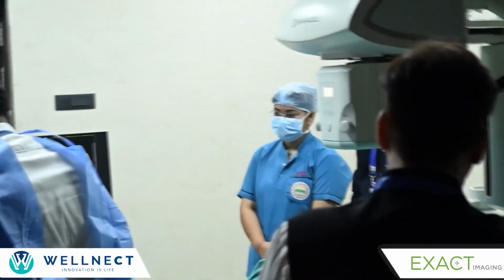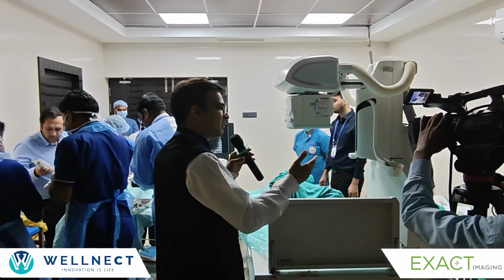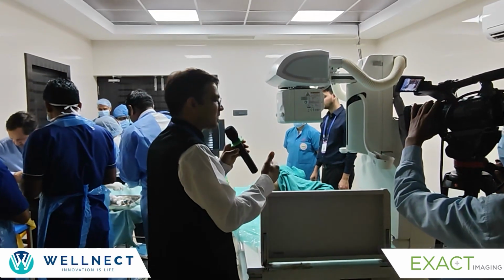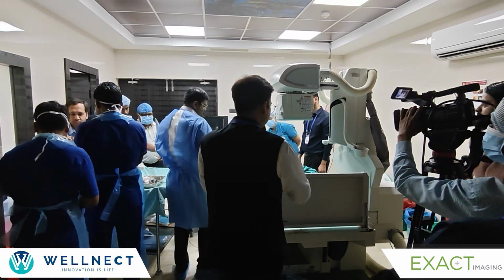Rest, if you go with the probe, all the features are equally there in both this machine and other machines, and these high frequency machines, and they are equally good. So I think the difference is the 29 megahertz transrectal probe, which Dr. Abhijit will now introduce.